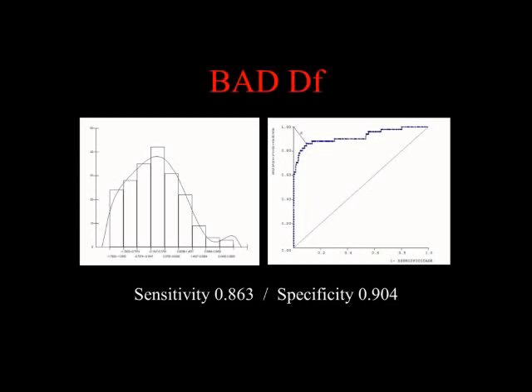So when we do the regression analysis and when we look at parameters, what we're really looking at is what are the individual parameters' ability to separate normal from abnormal? What's their sensitivity and what is their specificity? And the way we can improve on any individual parameter is to use multiple parameters. And we kind of know that from glaucoma. If all we used was IOP, we know IOP is important, but it turns out that it's not overly sensitive or specific. And if we look at cup to disc, it's not overly sensitive. But when we start combining IOP, cup to disc, family history, nerve fiber layer, all the parameters combined, we improve sensitivity and specificity. And that's the goal behind any regression analysis.